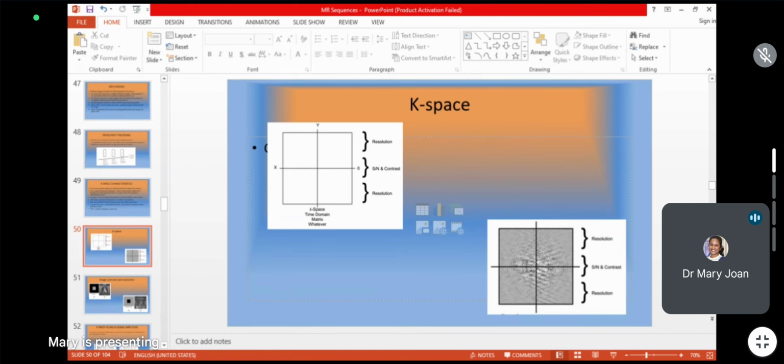So I think you understood. Two people, say Harshita and Vishwa, are sitting close to each other. When you are looking at them, how well you are able to identify Harshita as Harshita and Vishwa as Vishwa is resolution. And how clearly you are able to see each person is contrast.